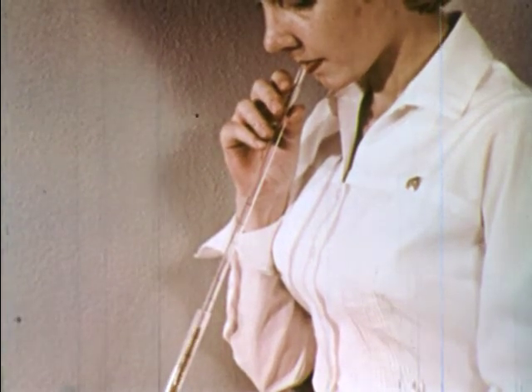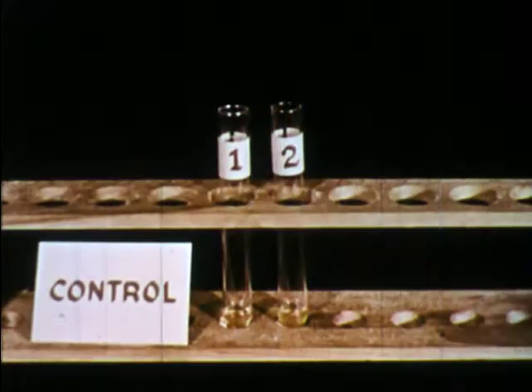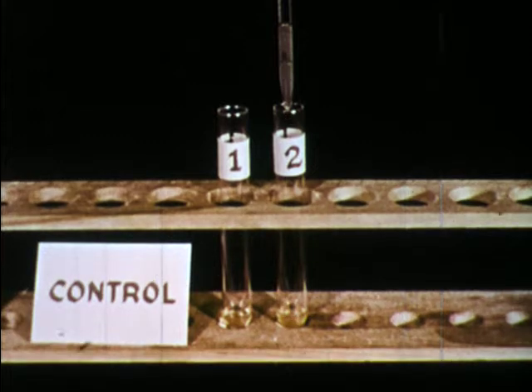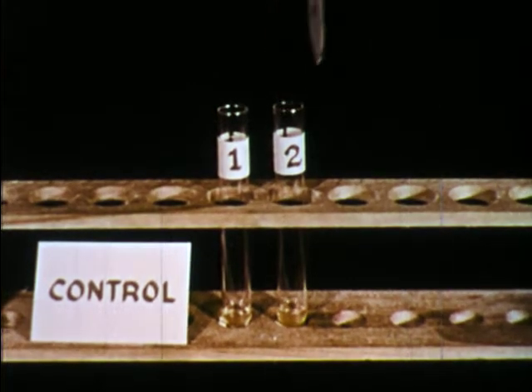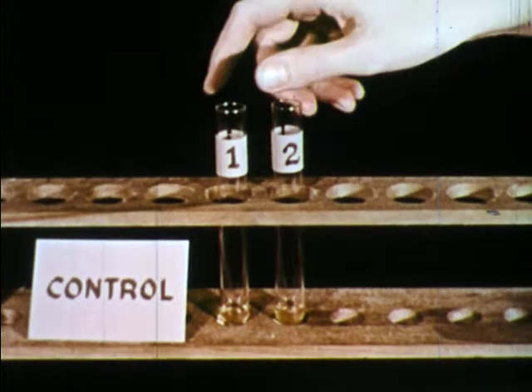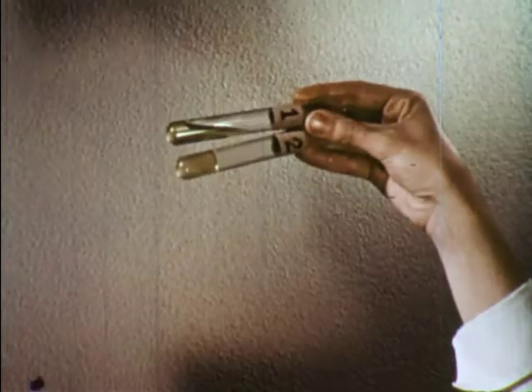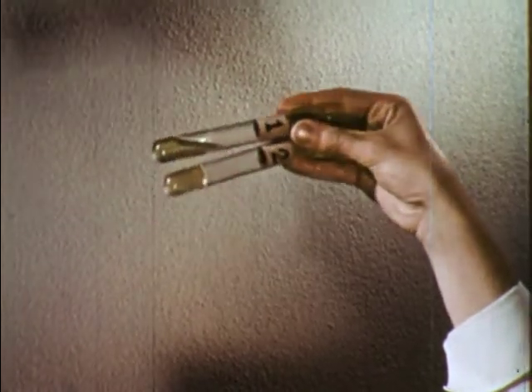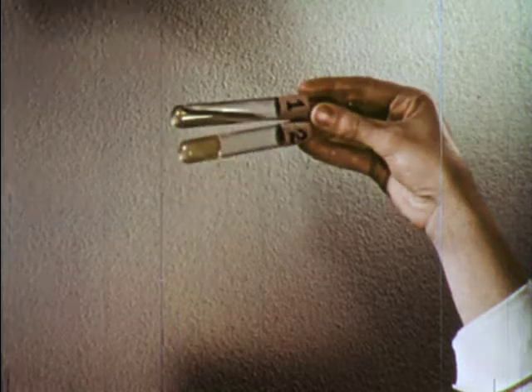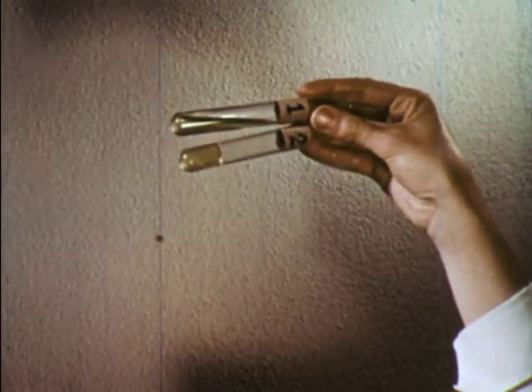We can show this by removing the plasma from a tube of centrifuged blood. Now we add to the second tube only some of the juice that comes from injured tissues. Tissue juice contains a substance which activates the blood clotting mechanism. Since this tube contains only plasma, we have demonstrated that plasma can clot when exposed to tissue juice and that red cells are not necessary for clotting.